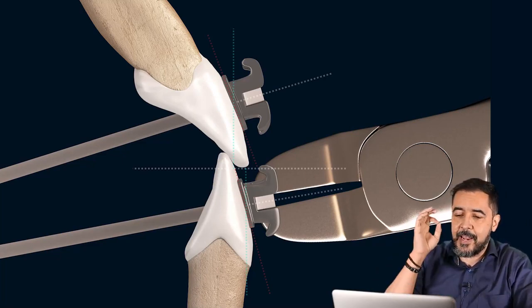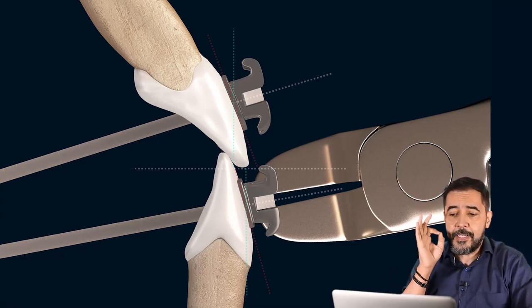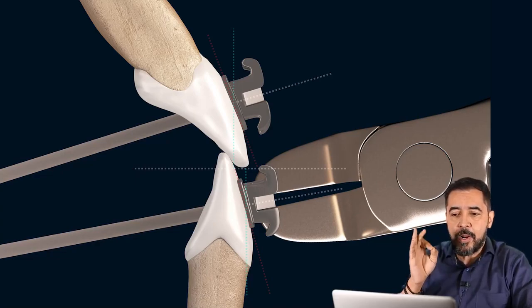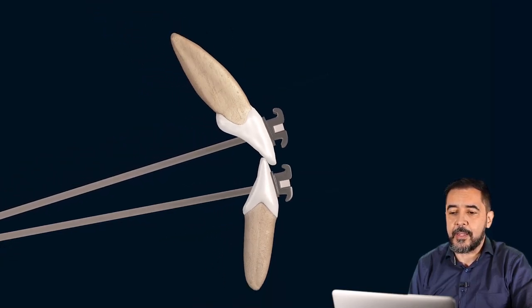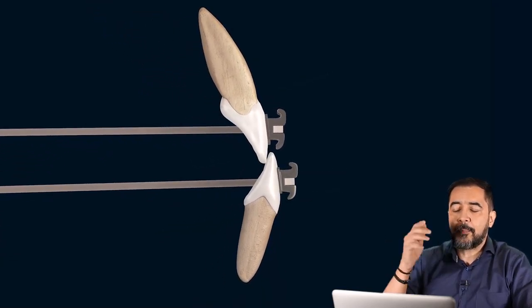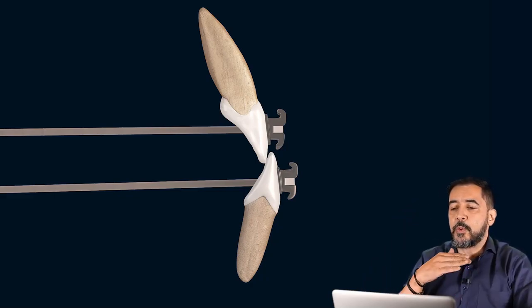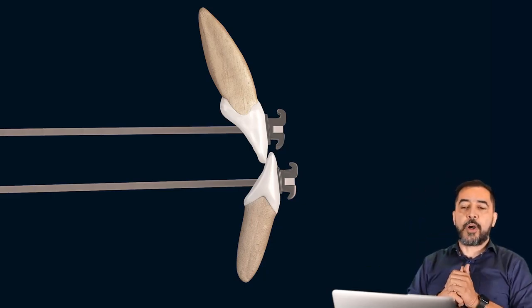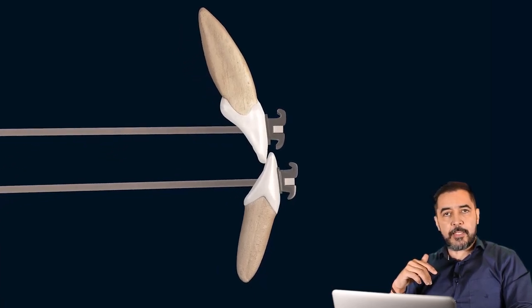So this is an active relationship. It's an active relative torque. And this active relative torque will do something like this to your teeth. To the upper arch and to the lower arch, different moments are generated. To the upper arch, we will have a negative crown torque, and in the lower arch, we will have a positive crown torque. So we had this before, and now we have something like this.